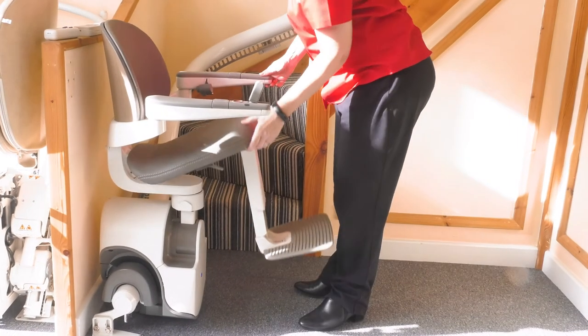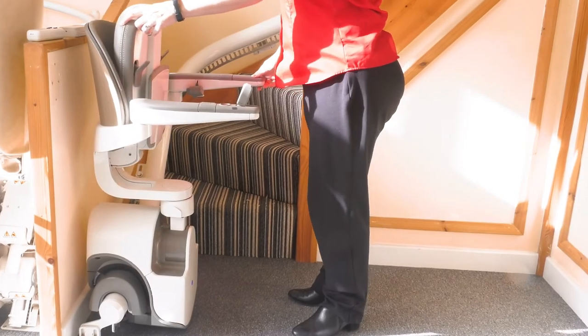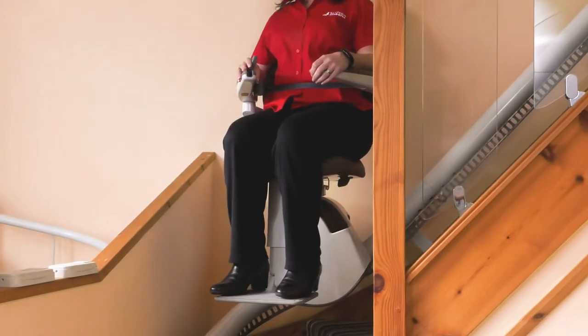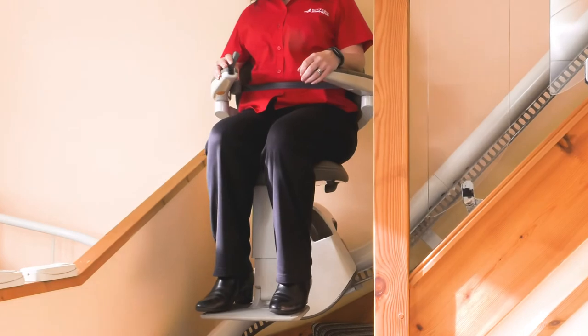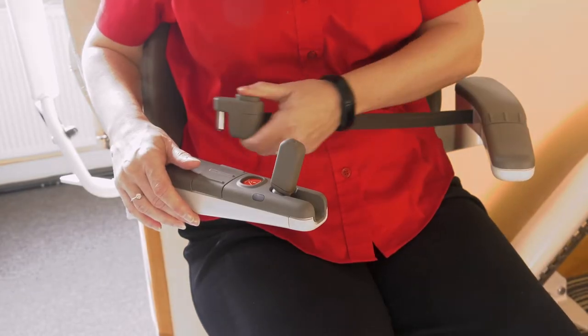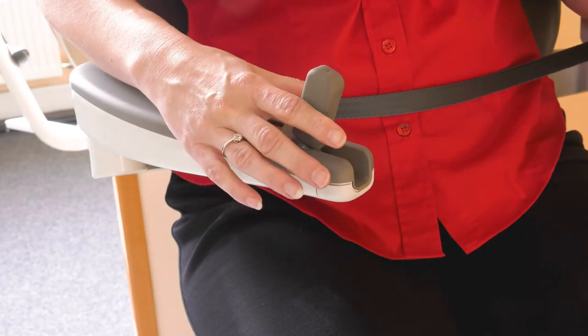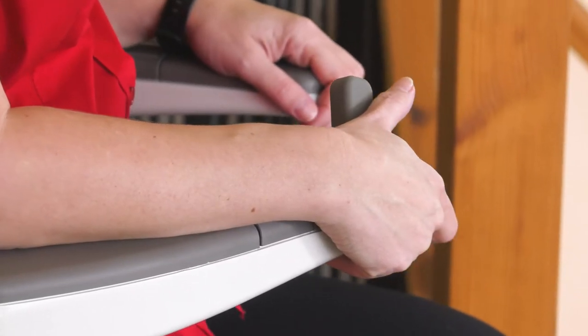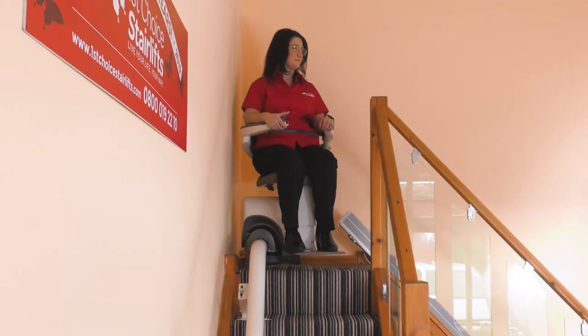The chair and footrest folds when not in use, or you can leave it unfolded and ready to go. For narrow stairs the lift can travel in a downward position to negotiate tight bends. The Flow X is easy to use: just sit in the seat, fasten the seat belt and press the arm control in the direction of travel with constant pressure until the lift automatically stops at the end of the rail.